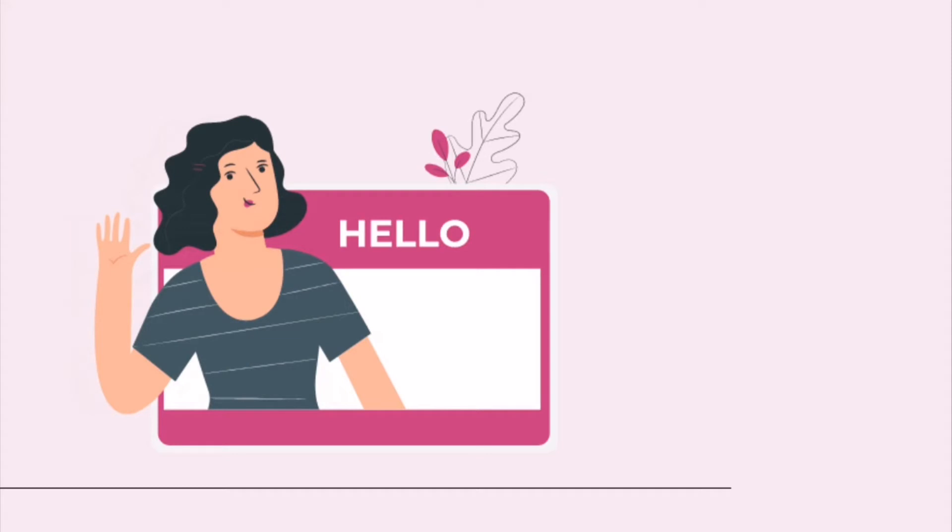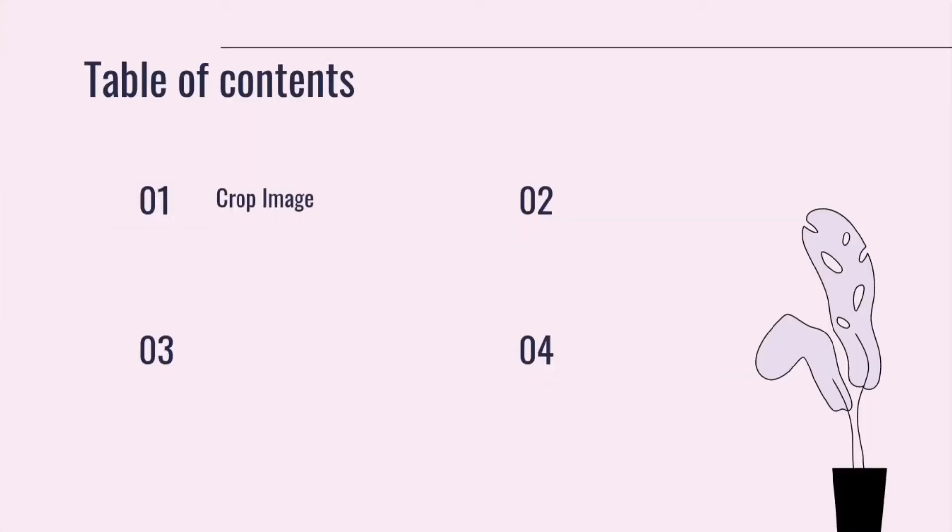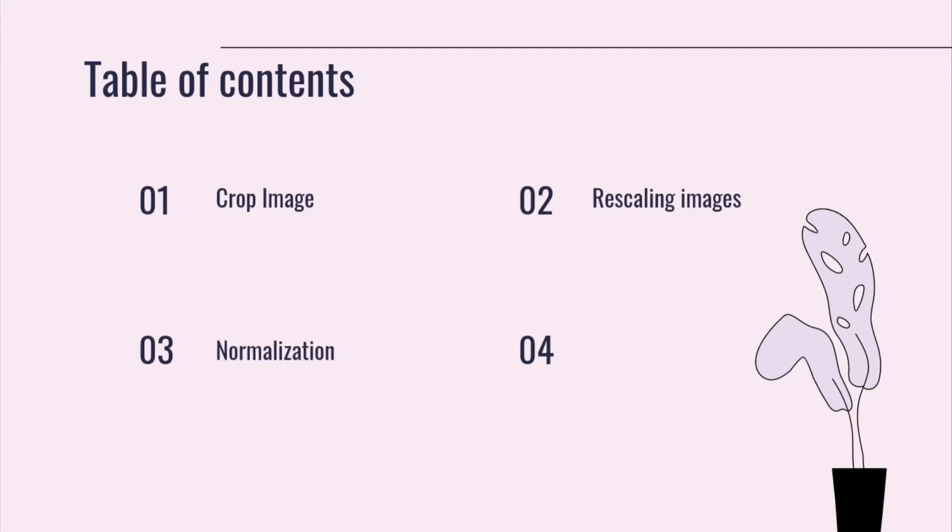Hello, I'm Fatima Behrad and in this tutorial I'm gonna talk about medical image preprocessing. Like my previous tutorials, I use Brat's dataset as an example dataset and I write my Python code on Google Colab. In this video, I'll show you how to crop, rescale and normalize images. Also, in the final part, I'll talk about bias correction. So, let's begin.